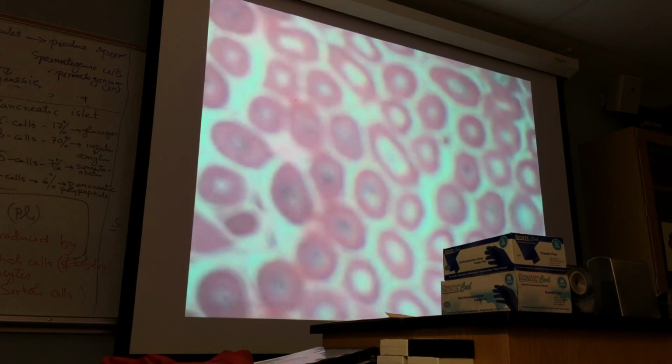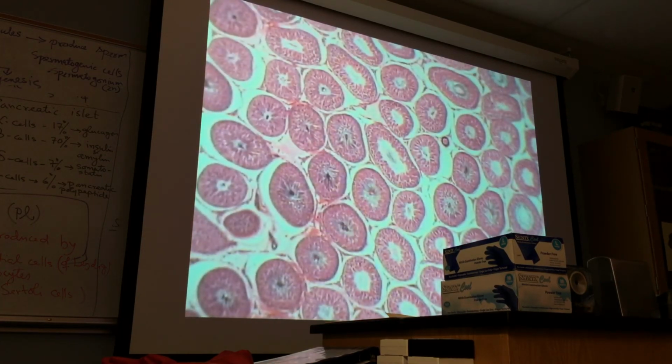Okay, if I have this and you'll have no problem in identification of the organ. If I ask you identify the organ or identify the structure, just plain and simple, testis, and make sure that you write this spelling, testis. Okay? Now, some accessory structures.